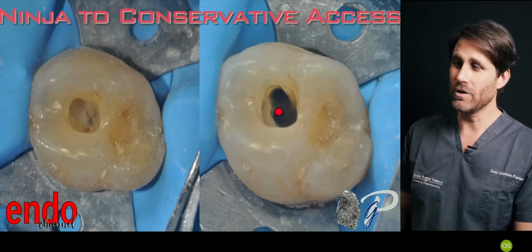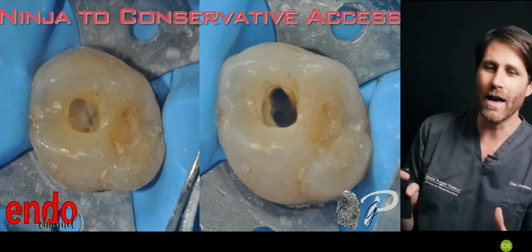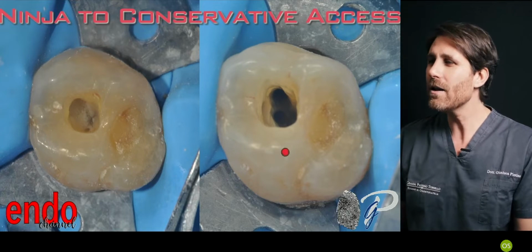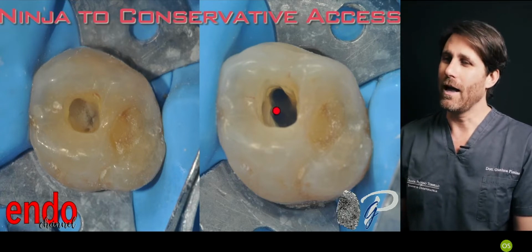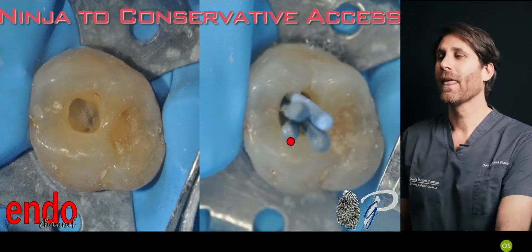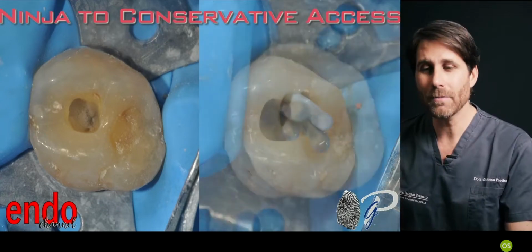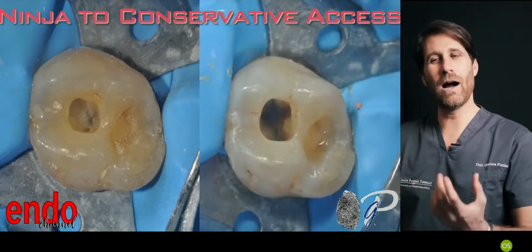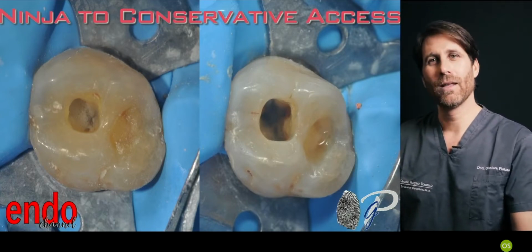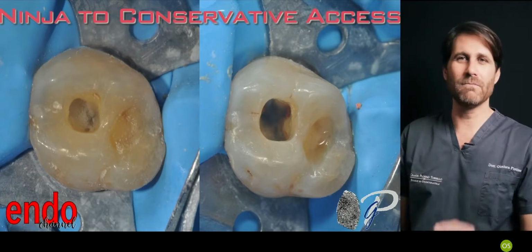In this case, the most difficult is the MB2 root canal, that we can clearly see through this access, just by moving our head, our microscope, our mirror in another direction. We can clearly see the two canals and treat them, even if we don't see the other ones. And we can perform the three-dimensional obturation through these spaces, and we will see the strategies of how to obturate these canals during this journey with our endo channel. So Ninja to conservative is my rule.